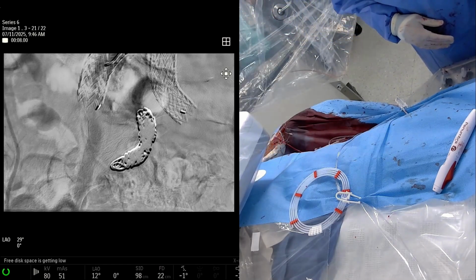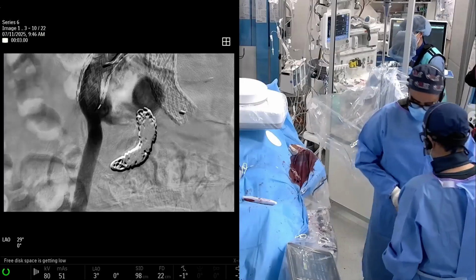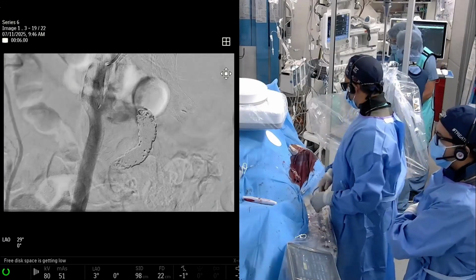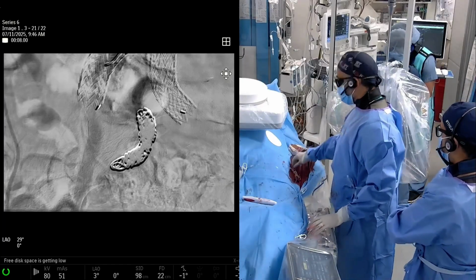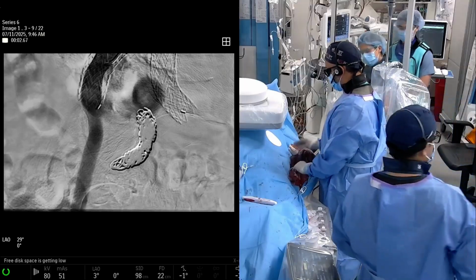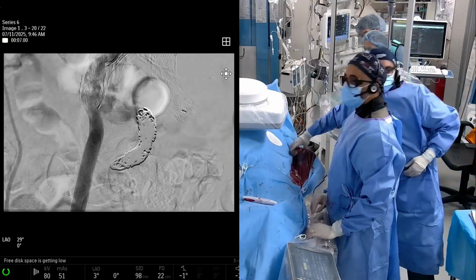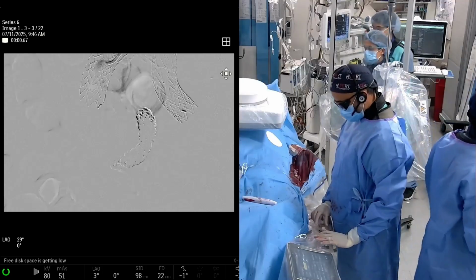We're not going to put the limb today. We're going to do the limb as a separate staged procedure. So actually, we're going to show how we get out, just because hypoembo is not super interesting. We're going to show how we put the TR band. Can we get a regular? Regular TR band, and we'll show you how we exit here.